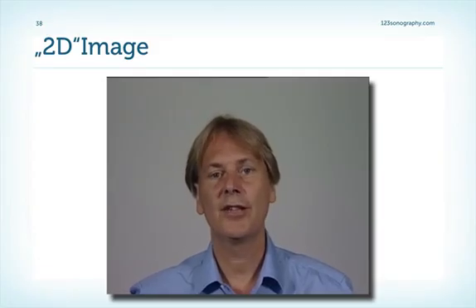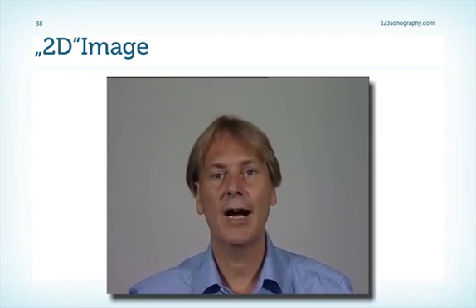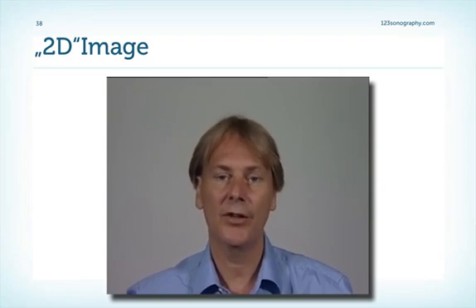So this concludes the subchapter on two-dimensional imaging. With all this information in the back of your head, in the next chapter we will turn to how to optimize the 2D image on the ultrasound machine.